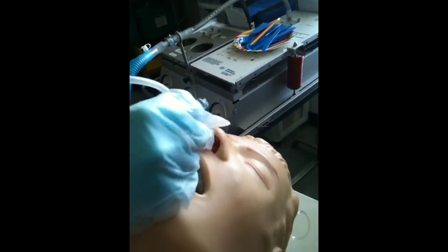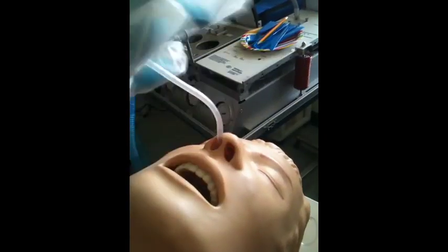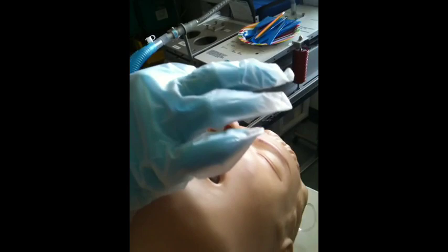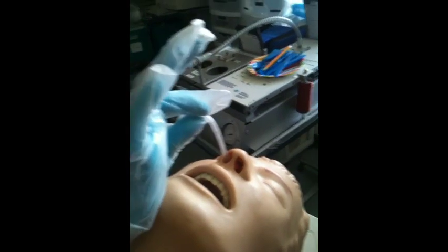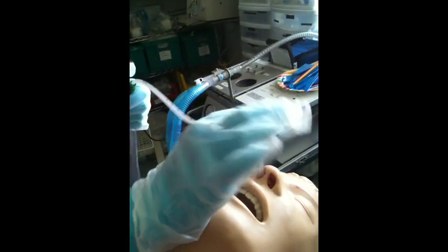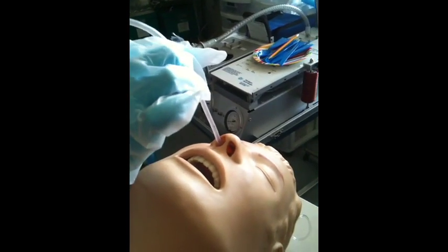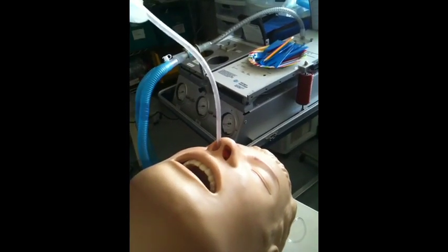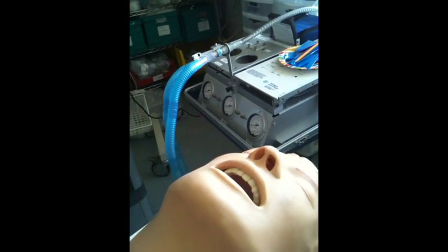The catheter will go in as far as possible until the RT reaches resistance. Once resistance is met, you pull out a couple centimeters, and then the RT will apply suction and twist the catheter out, sucking as much secretions as possible. Clear the catheter with saline after complete removal.